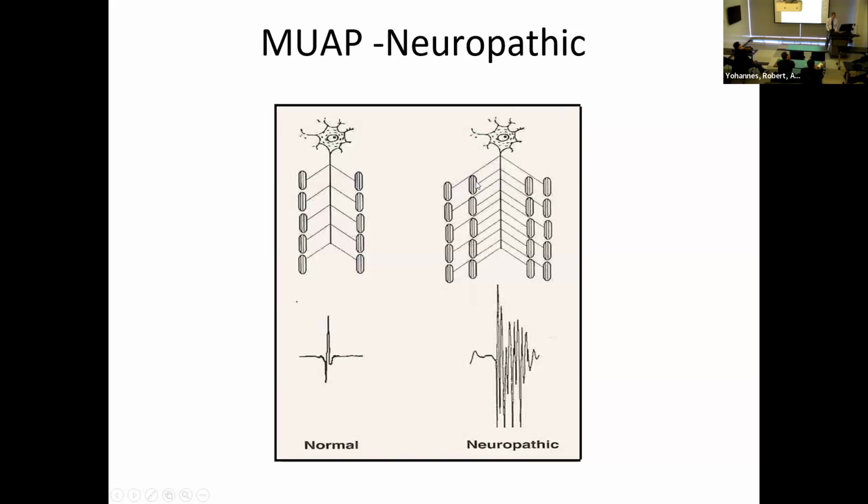And so the original ones will get their action potential and be activated early. But those that were recently incorporated and have demyelinated axons connecting to them will take a little bit longer. So in the beginning, we'll see the original ones. And then later on, we'll see here, I hope you can see the mouse, you can see the others being incorporated.